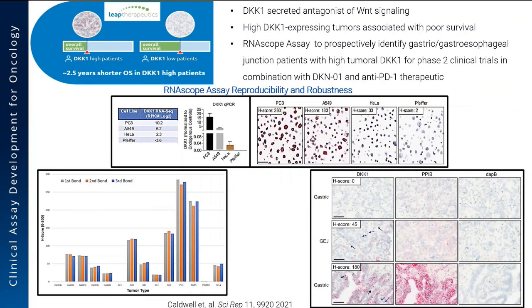While we do look at the staining pattern and the reproducibility, it is the final analysis that tells us about the expression pattern. Once reproducibility is established, it is not only important to visually match the images, but you would also need to analyze the images, the best way being quantitative analysis. And the best way to do this is H-scoring, which shows that the pattern is replicated. And in most clinical studies, they go through this.